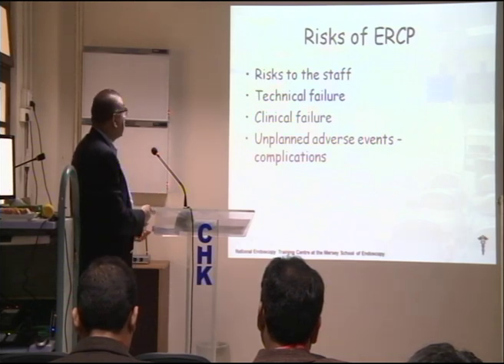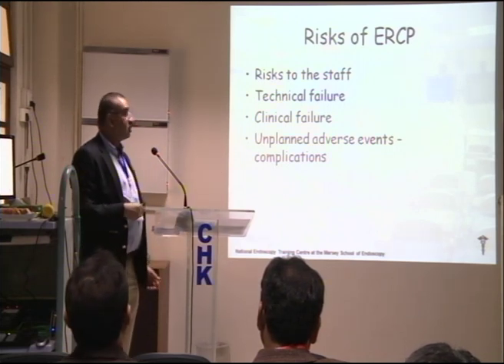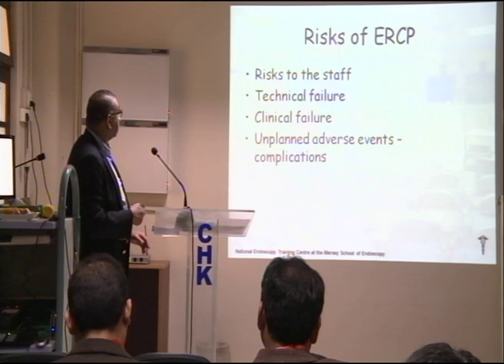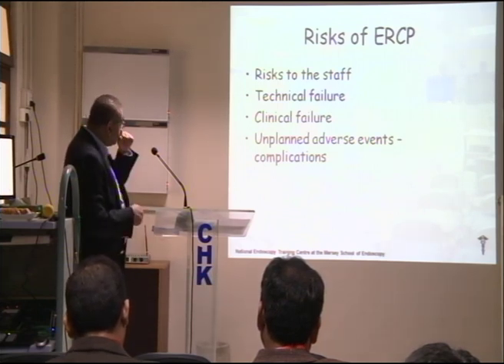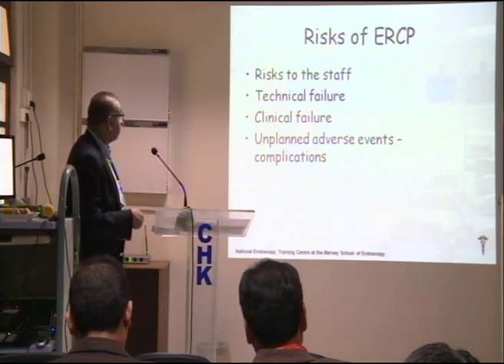Technical failure can occur, especially a scope can break down in the middle of your procedure and everything goes dark. So in that case, the best thing to do is to come out. Clinical failures can occur due to technical reasons, failed cannulation or anything. Unplanned adverse events are complications.